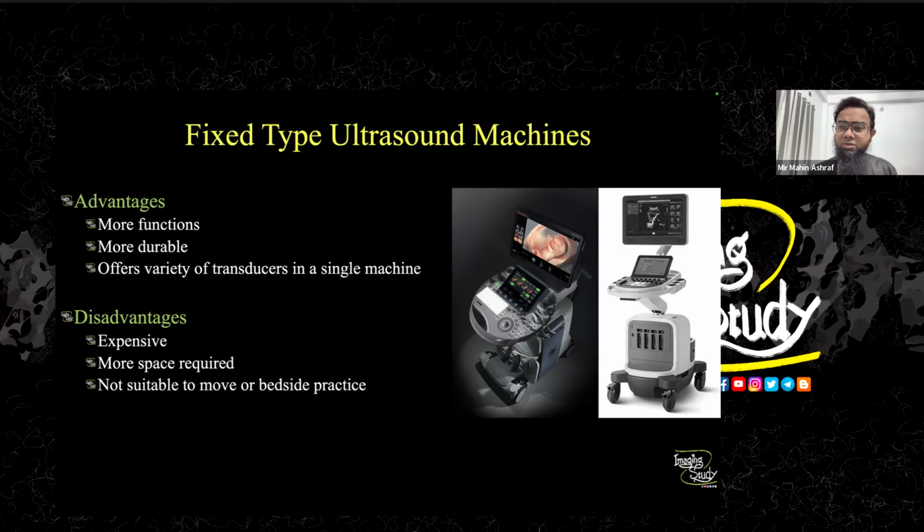Obviously, so there are durable machines with a very good. They offer different types of transducers in a single machine. Like you can see many ports here for the transducers, but they have some disadvantages.